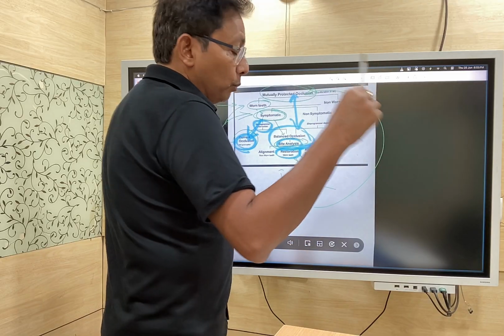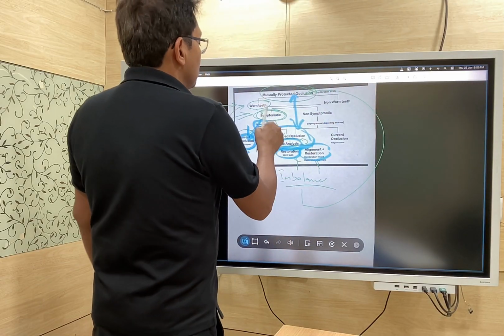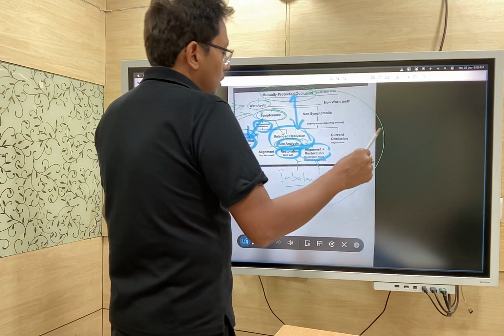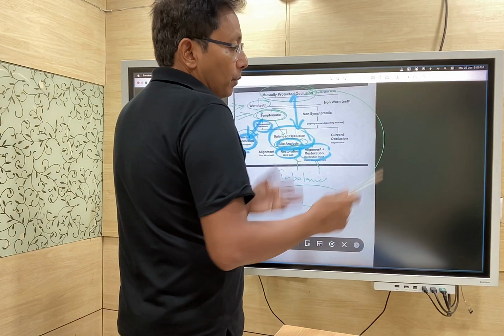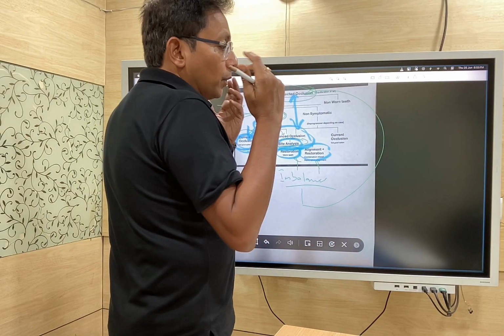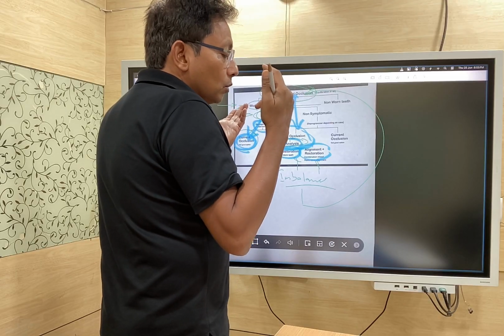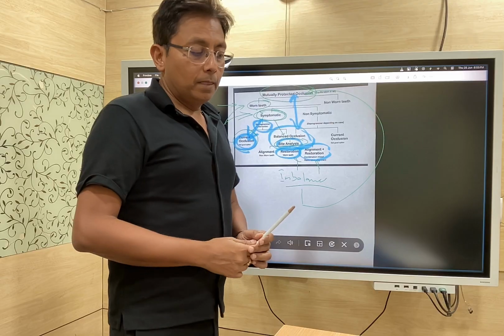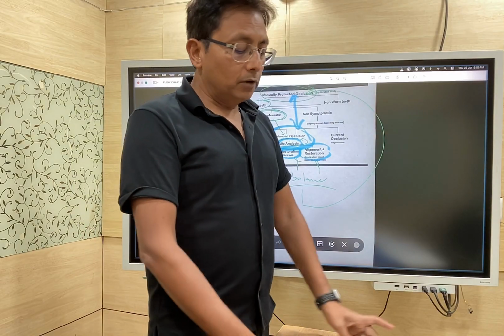So before placing aligners, you see yourself whether you are symptomatic or you have a worn status of teeth. So ask the doctor what will happen to my worn teeth and what will happen to my TMD symptoms by putting the aligners only, whether they will be corrected or they will worsen.